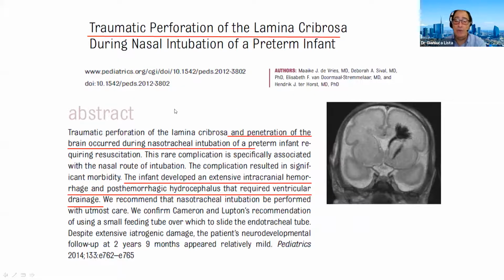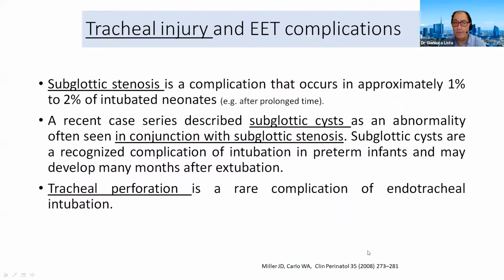During nasal intubation, you can damage the lamina cribrosa, you can cause a perforation of the lamina cribrosa, you can damage the brain. This condition is very rare, but in this baby, the traumatic perforation of the lamina cribrosa induced severe IVH and post-hemorrhagic hydrocephalus that required ventricular drainage.